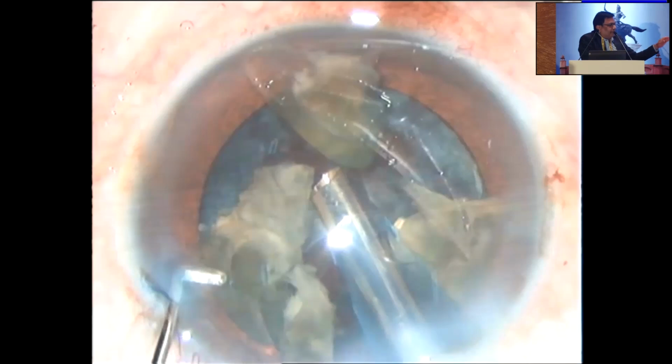In a normal case, this is very important. Now one phaco tip is crossing the center, it is beyond the center here. If the phaco tip is here, the current of water fluid is only this much. When it goes to the center, it will increase a little bit. So it does not require any top-end machine, any simple phaco machine will do.